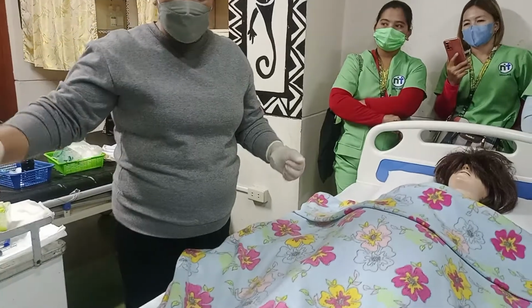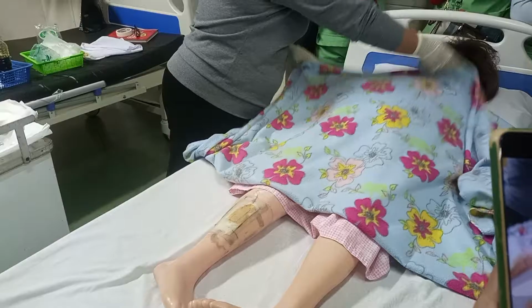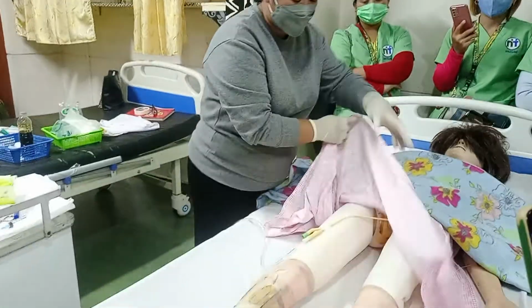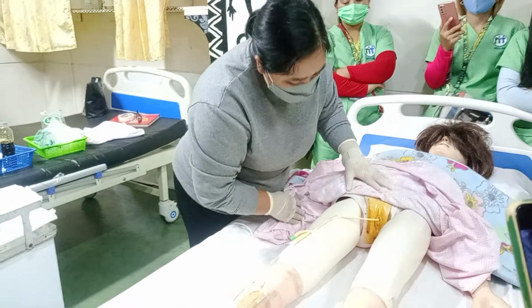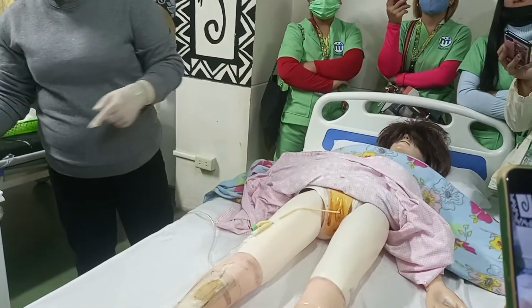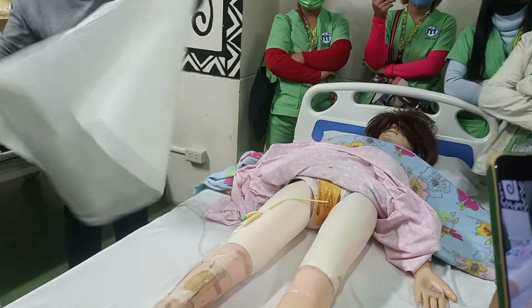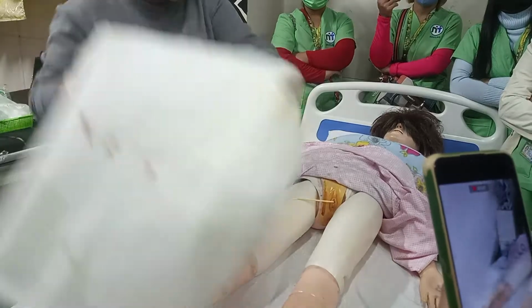And then now, Mrs. Smith, I am going to move the blanket to reveal and for me to see and access your perineal area. Okay? Alright, so there. Pag hindi naman masyado or walang secretions, you may not put the underpad. Pero pag nakikita ninyo na meron or there's a tendency na maisbo, then you may put the underpad. Okay? So there.